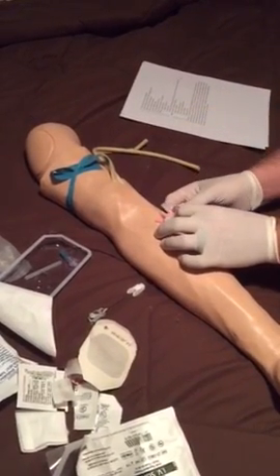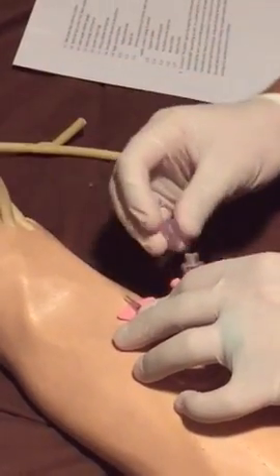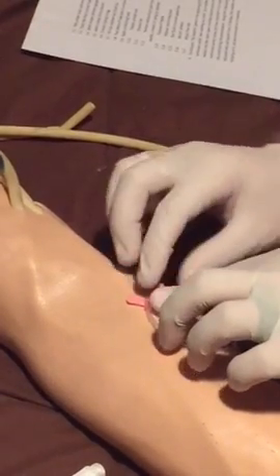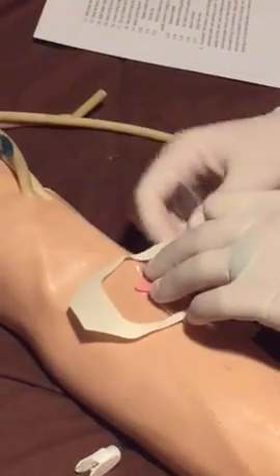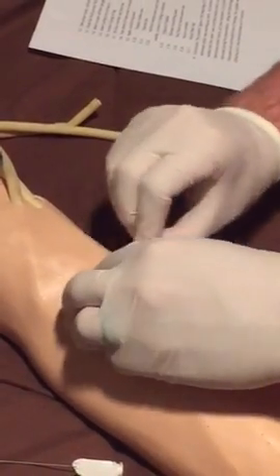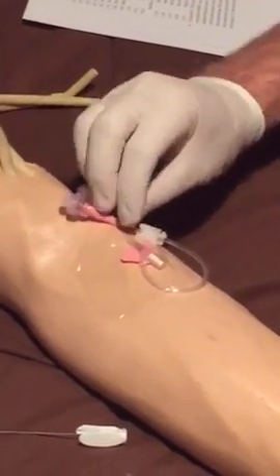to drain it, and then after that, with these, you actually want to, so that you don't have any fluid running from the other port, this extra port just stops it. And then we're going to use our Tegaderm. Give us a nice window and seal it so that it can't go anywhere. And then after that, we're going to use the tape that we set aside, and we're going to set this up.